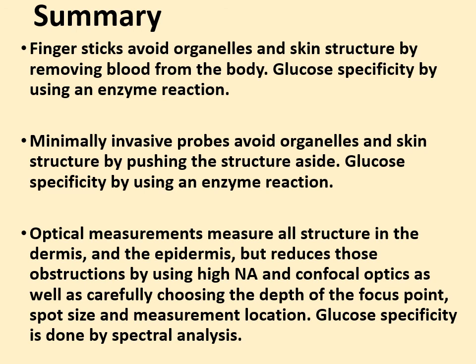As far as glucose specificity, well, you can't separate it with an enzyme chemically, but you do it mathematically by analyzing the spectrum that comes from the light and separating it out that way.